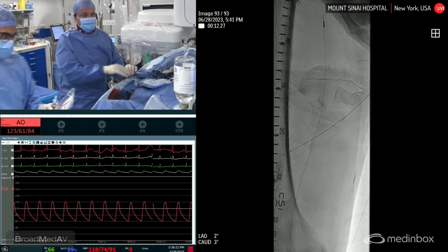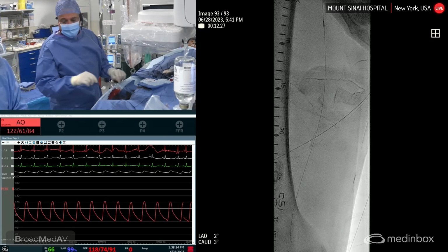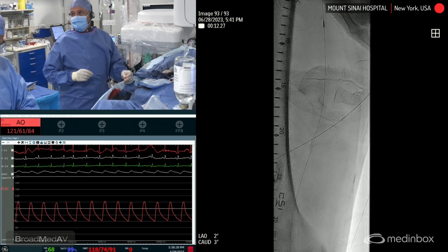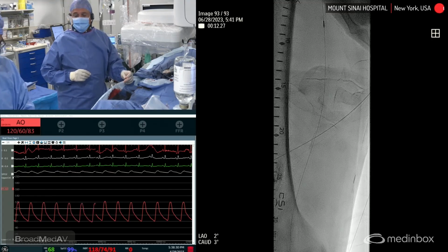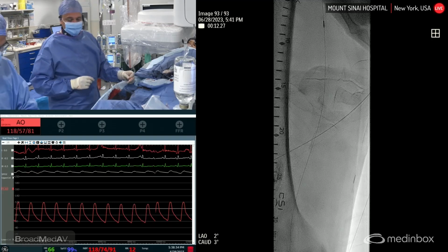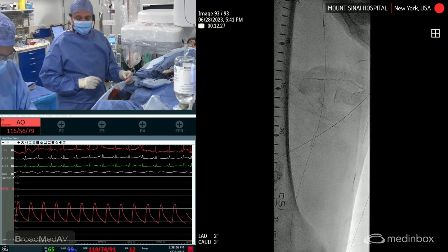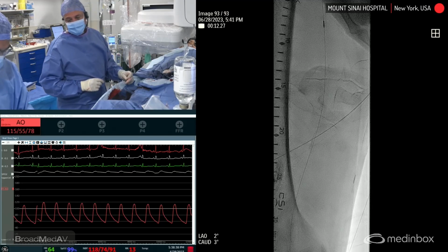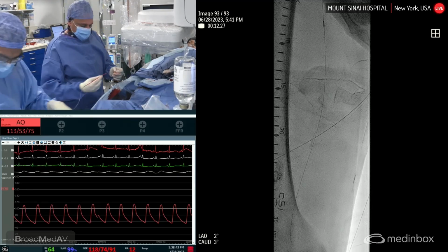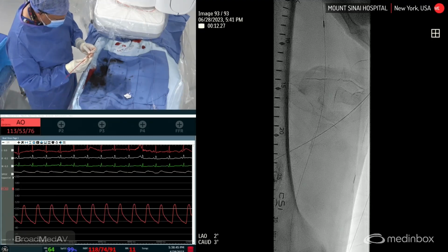Let's hopefully it passes. I'm taking bets from the audience. Please send me your text on how many of you think it won't cross, because I am here to say that it will cross. I may be wrong. Let's see. It will cross. Pretty tight. Let's see. The pressure's on, Medtronic. The pressure's on. So we're going to go ahead and load this up.